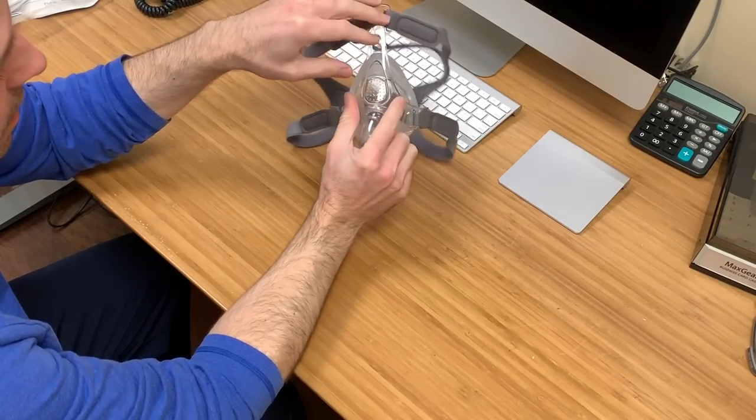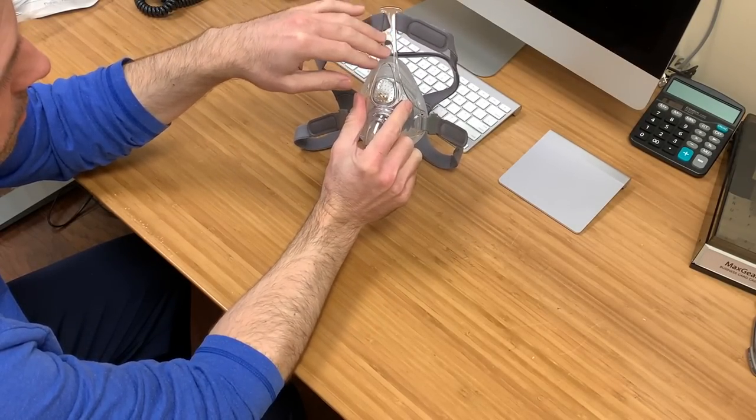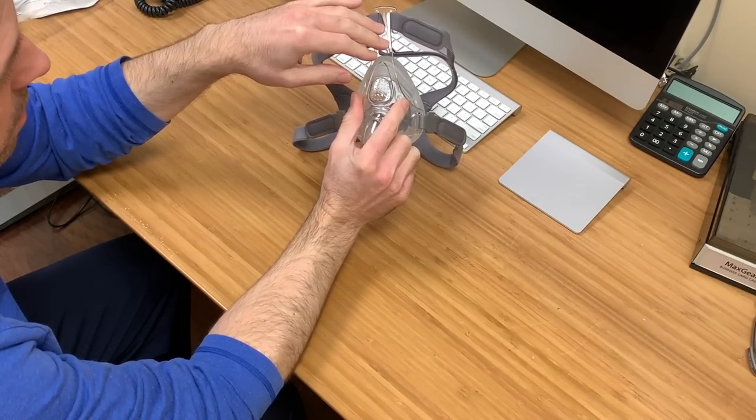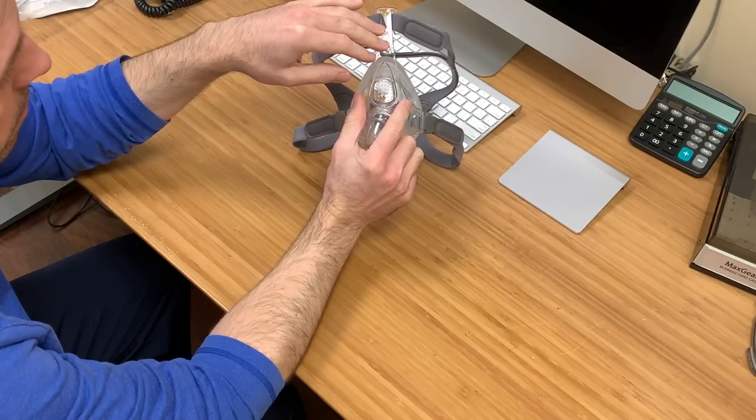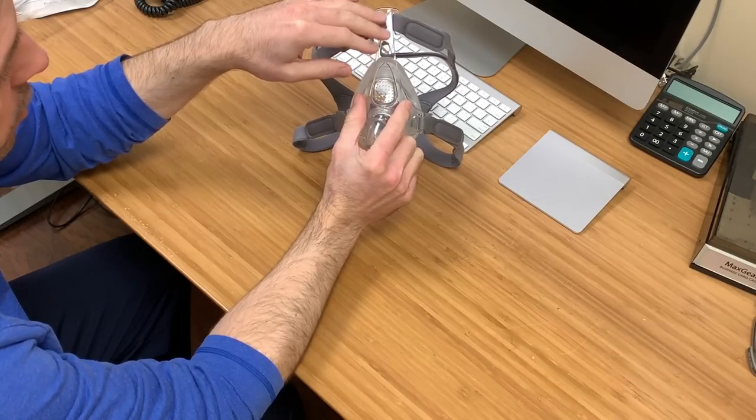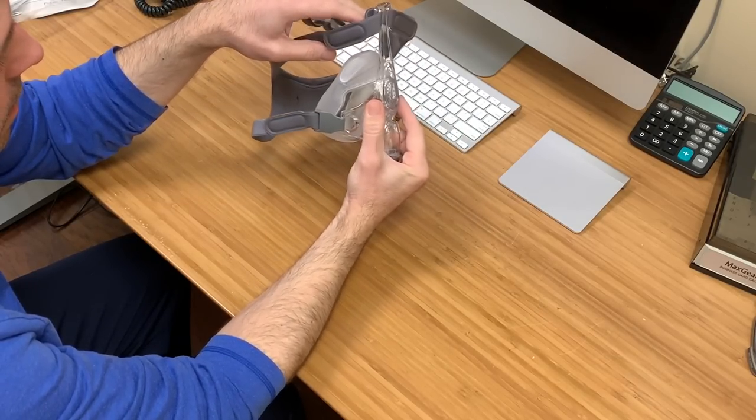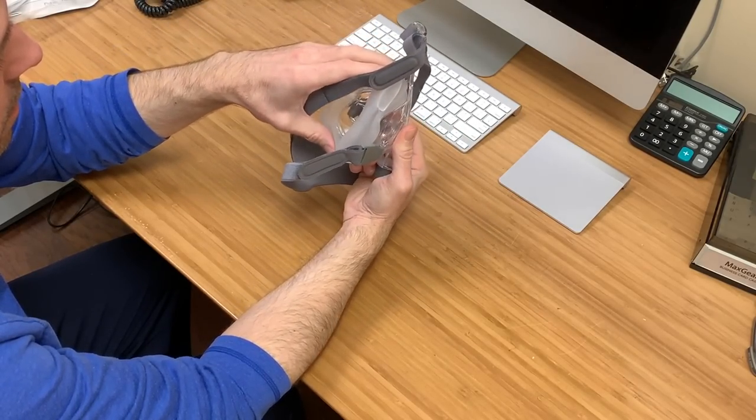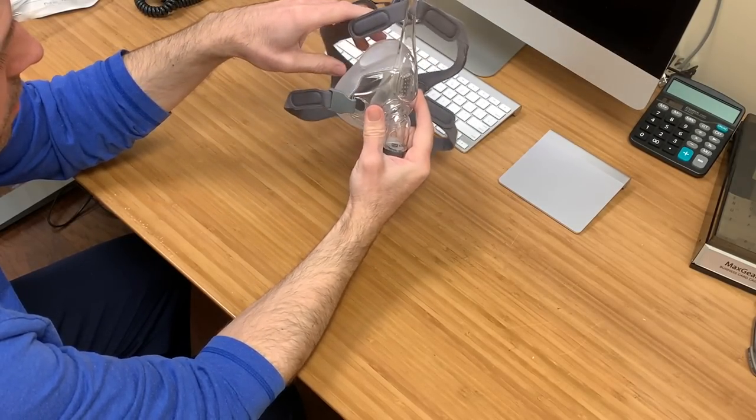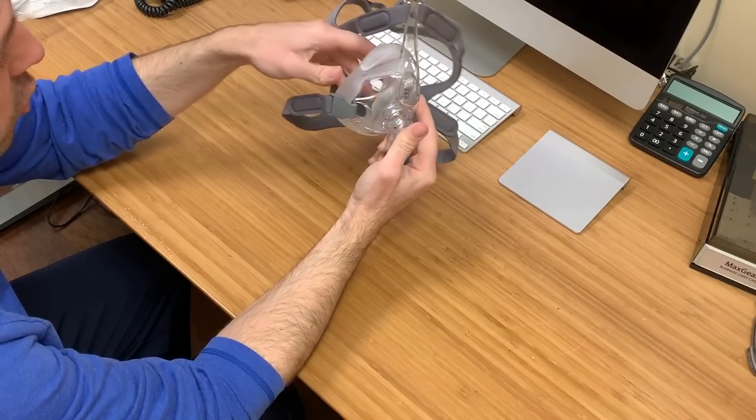So this is a great device for measuring up to your face, making sure that the mask is on correctly.